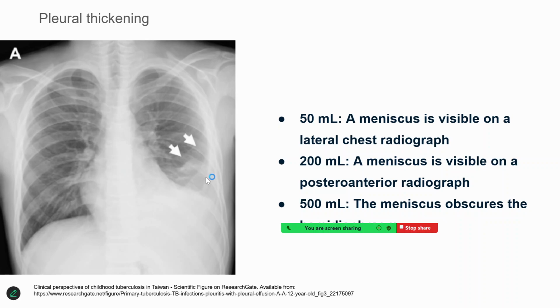But still, there could be many exceptional situations. Fluid can be better made out with ultrasonography. The normal quantity of pleural fluid is less than 5 ml, and with a perfect ultrasonography, even that can be identified. Whereas by plain X-ray, the smallest quantity of fluid which could be identified in a lateral chest radiograph would be 50 ml, and that too if it is perfectly taken.